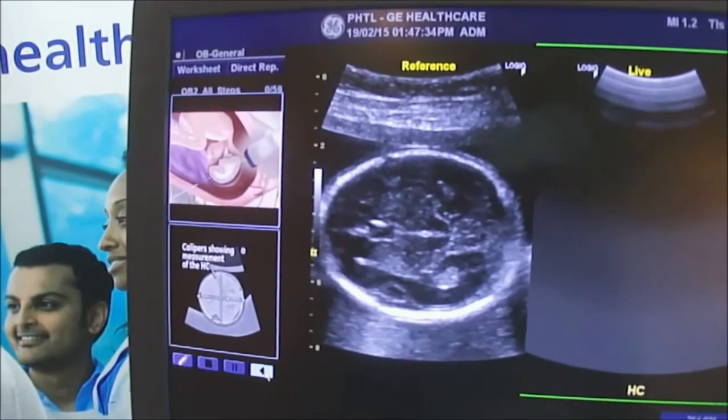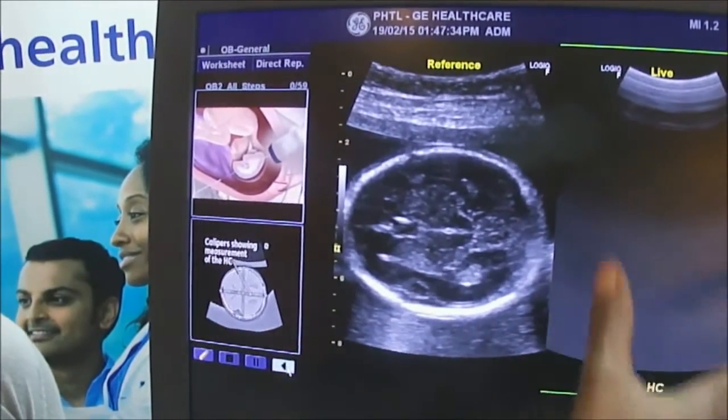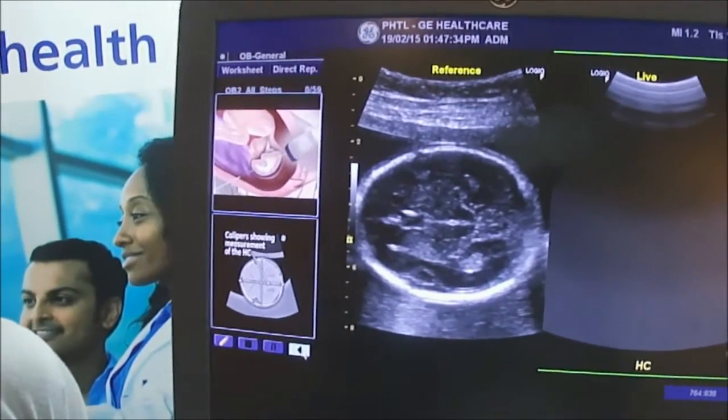For example, this is the head of a baby, a fetus, and when I scan the mother, I'll be able to try and get that same exact image.